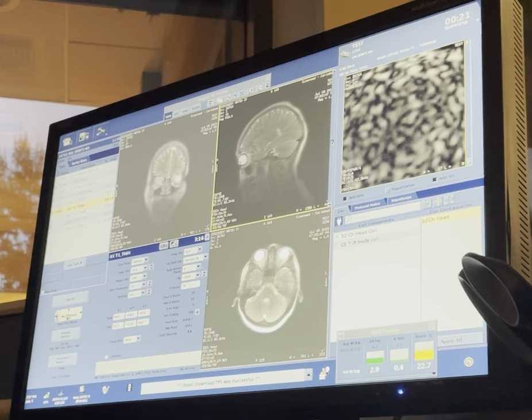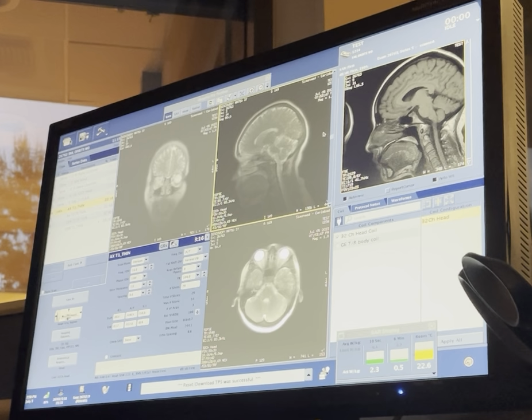Keep going. If that's, go back. So this is midline right here, probably. Go down one slice, let's see. Where's midline? It's hard to say. It's not angled super. Okay, no biggie. Let's bring up our new sagittal and I'll show you in a second.